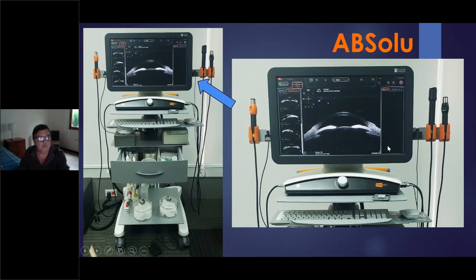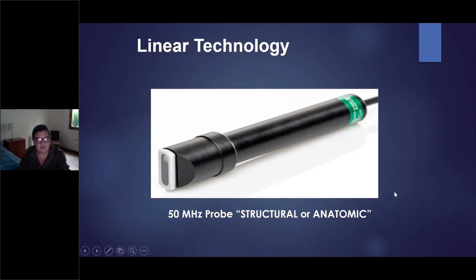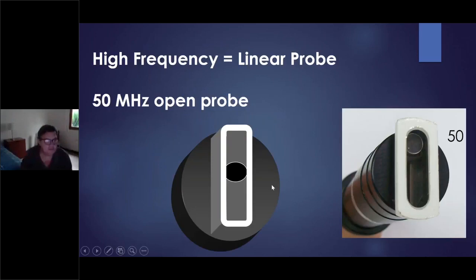These are the UBM probes. In this case, you have the 50 megahertz probe. I call it structural or anatomic because it has a very, very nice resolution. And this is improved resolution. It's a linear probe. This is very important. To do UBM, you must do UBM with the best machine.